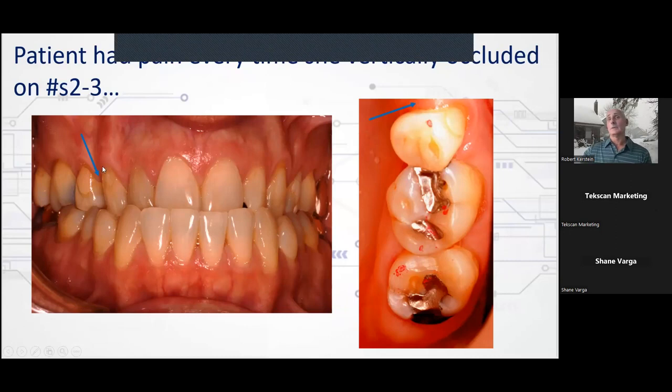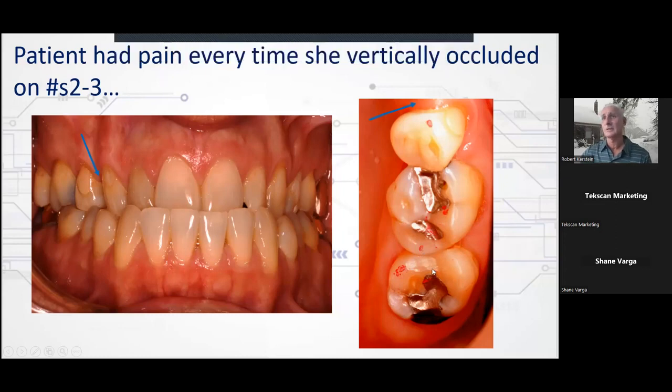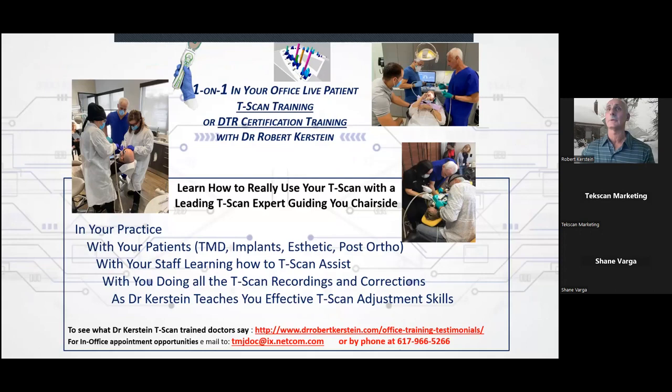So you can see this was the case, and it was essential to put in the half tooth and to figure out to get to this one contact, right? That was crucial. And that won the patient over. If I was grinding randomly and I said, does that feel better? She would say, no, it's still high. And does that seem better? I did it with one correction to one spot, right? That's pretty amazing. And as I said, I never met the patient before. If I couldn't set the T-scan arch up accurately, I never would have been able to do it.